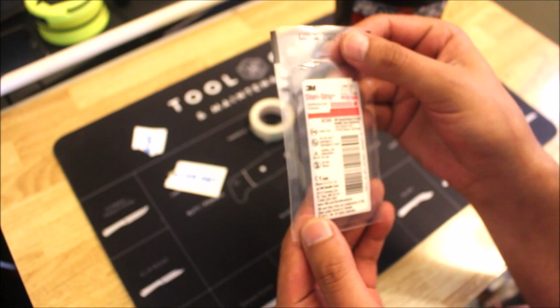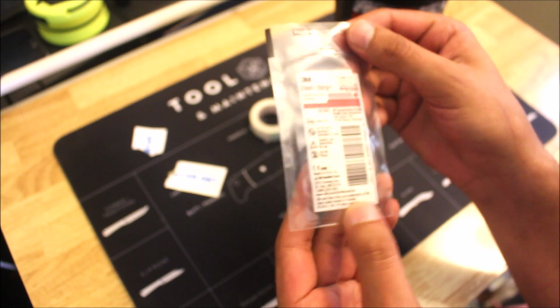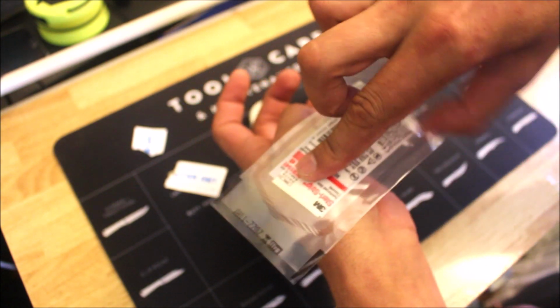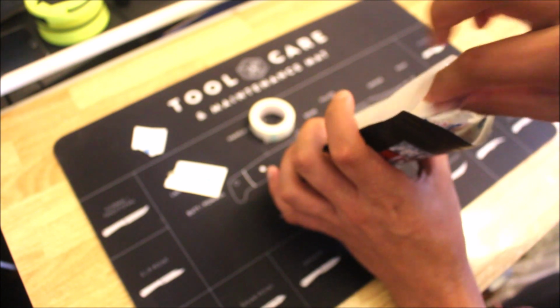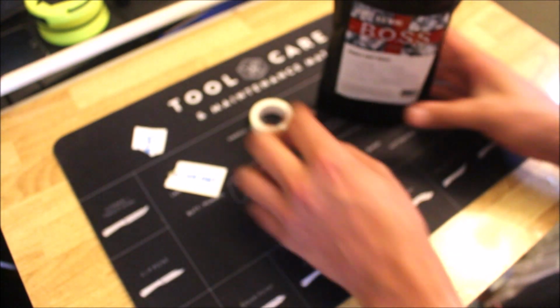And next up we have a 3M Steri-Strip. This is a 1/4 inch by 3 inches. And basically this is to, if you do have an open wound somewhere, you put this on there, kind of push it together, and it'll help hold the wound shut. So that's pretty cool. Because again, you don't want stuff getting in that wound and leaving it open to infection, because if that infection travels to your heart or something like that, it can kill you. And you definitely don't want that.